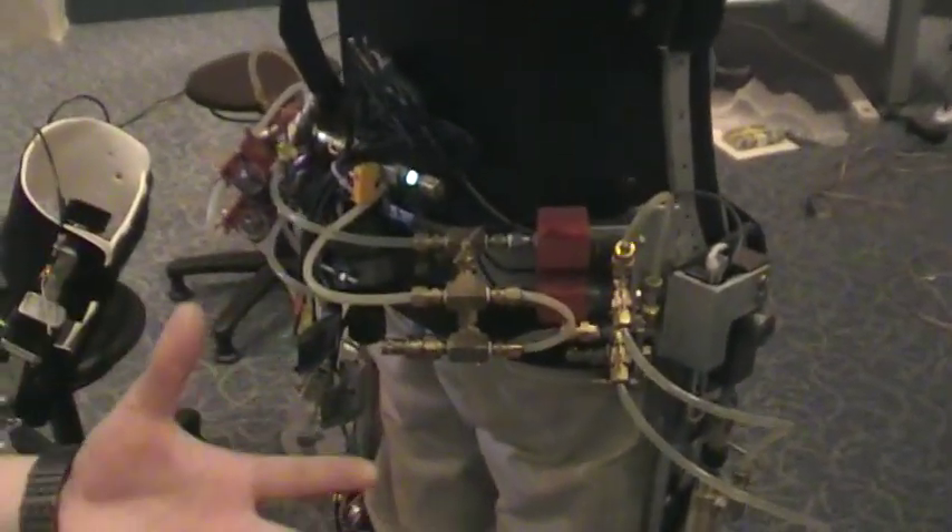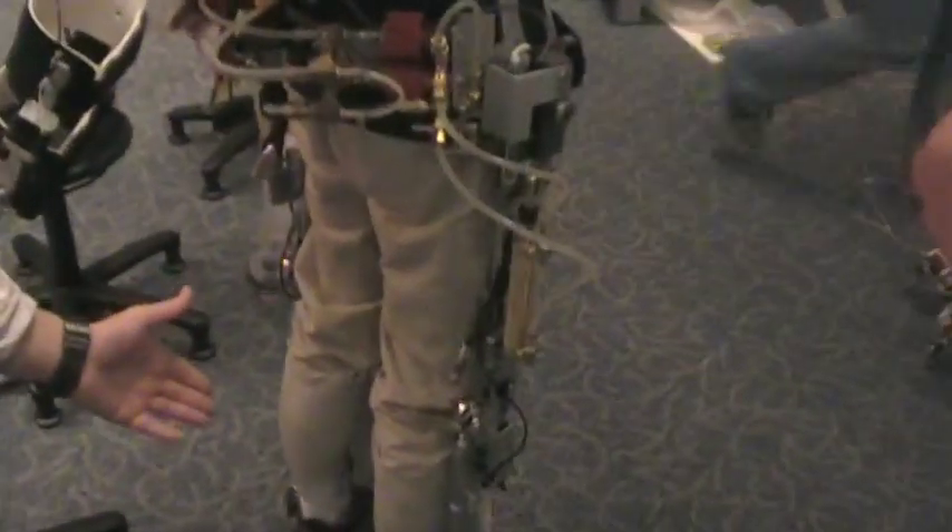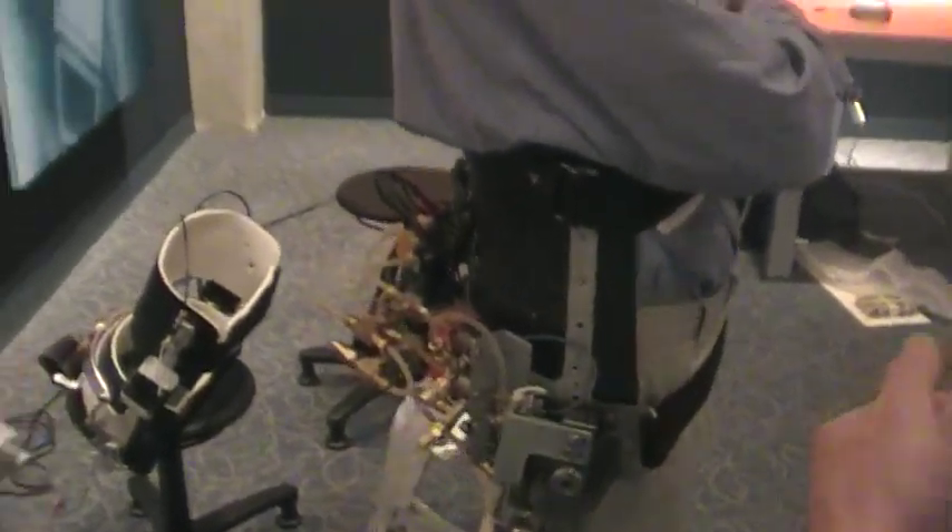There's also work being done on a new modified knee mechanism which uses MR fluid — magnetorheological fluid — so it actually changes the stiffness of the knee, allowing for shock absorption. There's also another mechanism being built for the ankle, which locks and unlocks the ankle and provides variable damping.